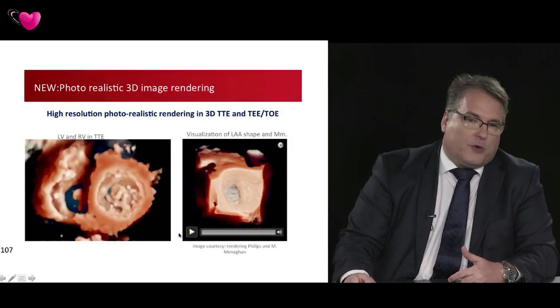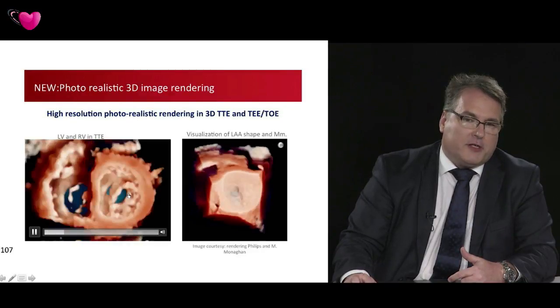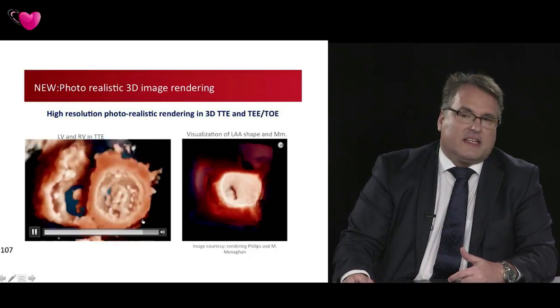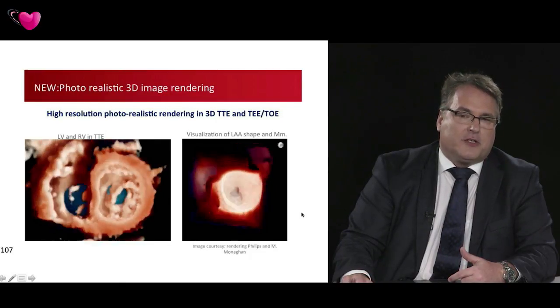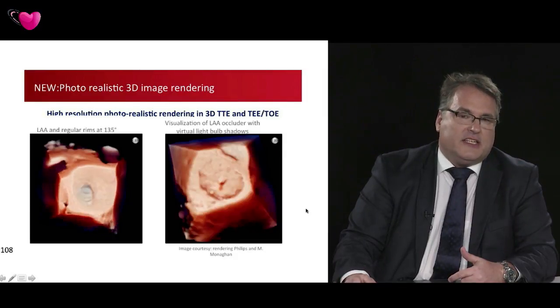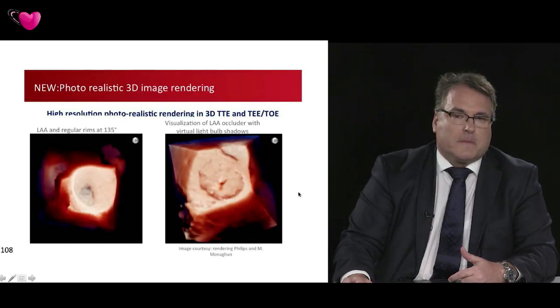And this was another question from the audience, whether we can use transthoracic imaging for mitral here and tricuspid leaflets that we see on the left-hand side, or the left atrial appendage that may be occluded in those patients as a bleeding risk. And you see it here before and after a Watchman implantation.